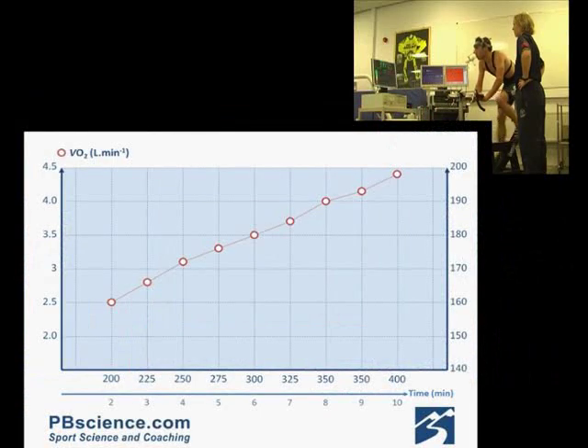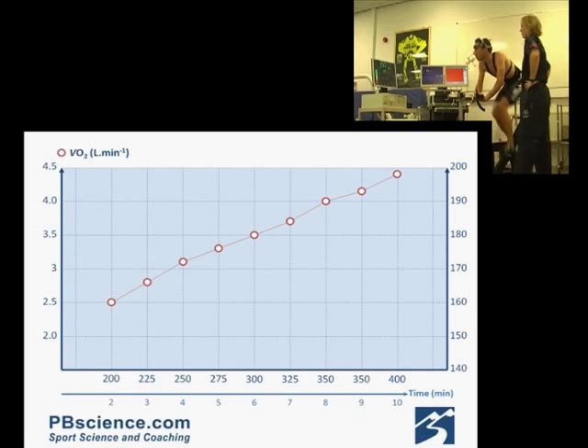We've now got enough data to plot this graph. As you can see, as power output increases, oxygen uptake also increases in a linear fashion. At 200 watts he's using 2.5 litres per minute, while at 400 watts he uses 4.5 litres per minute. This allows us to calculate that he uses approximately 10 millilitres of oxygen for every watt he's producing.